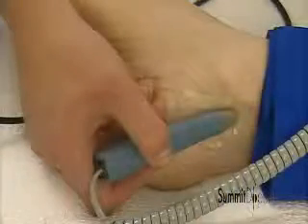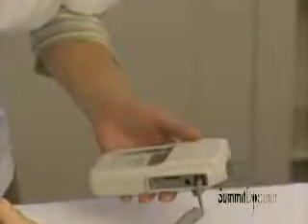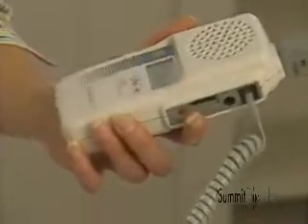Again, note the correct probe position and orientation at the posterior tibial artery. Once you obtain a good Doppler signal, wait at least 4 seconds for the buffer to fill. A good guideline is to count to 6 to ensure the memory is filled. Then, press the red button on the side of the Doppler to store the waveform. The waveform will print automatically as soon as communication is established with the printer.